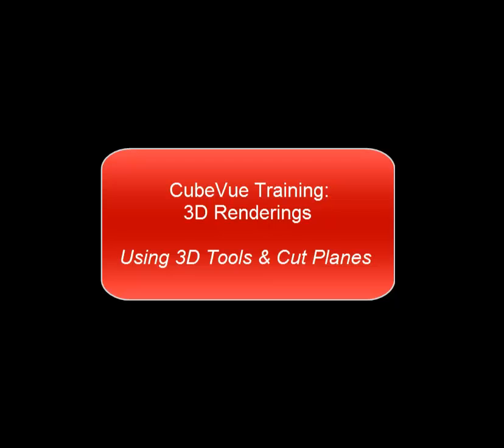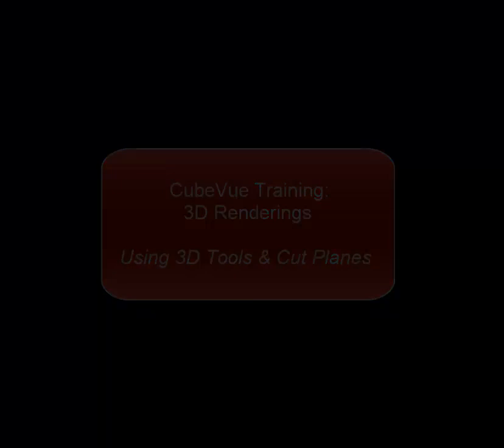QView software training for 3D renderings. How to use the 3D tools and cut planes.